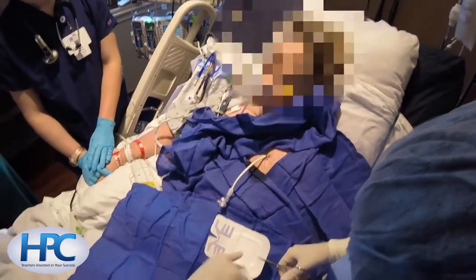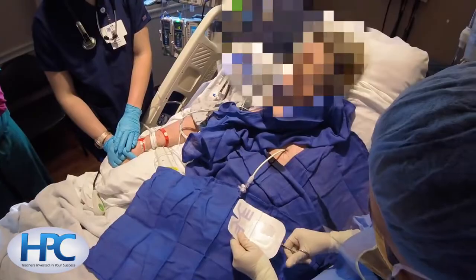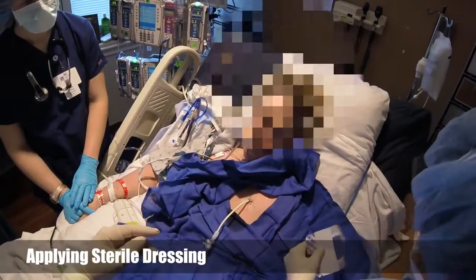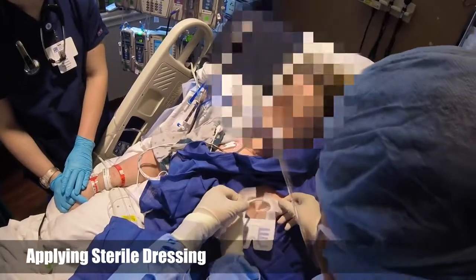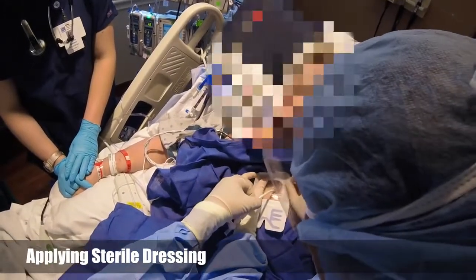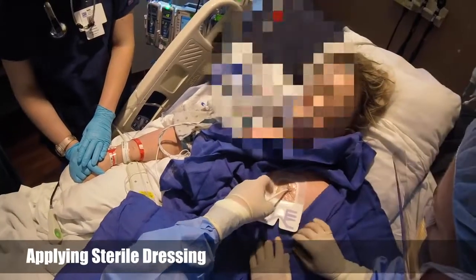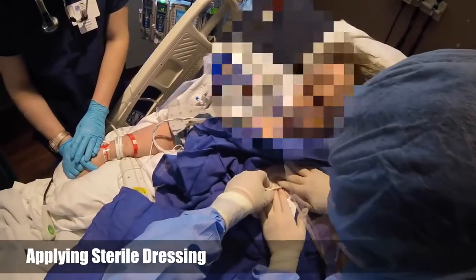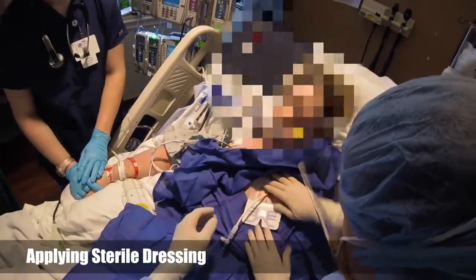Now we're going to cut a line through a sterile occlusive dressing, and then that hole is used to go around the catheter, so we have a nice sterile dressing around the catheter to minimize the chance of an infection.